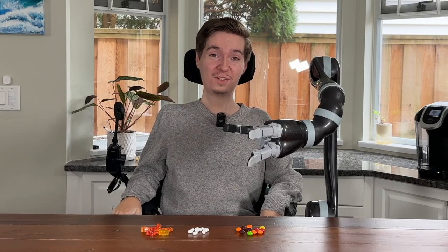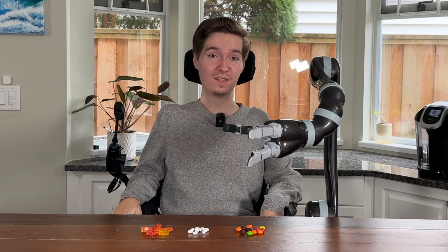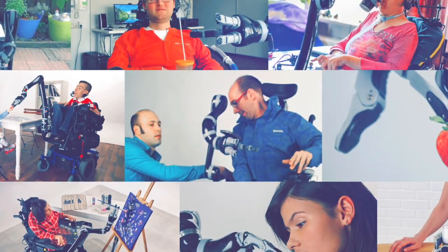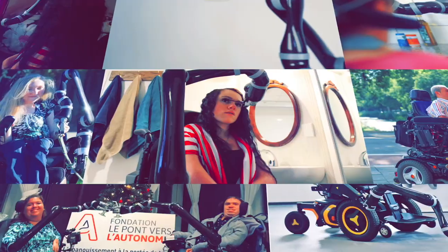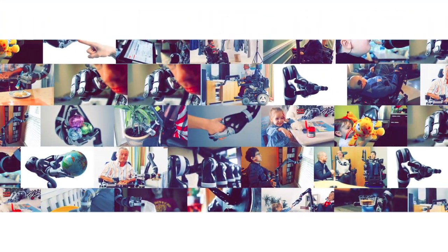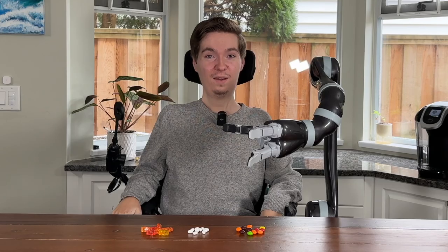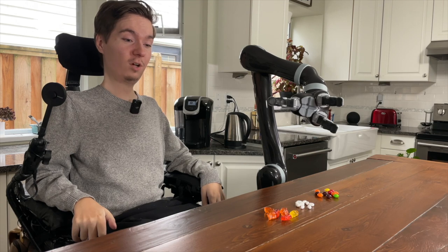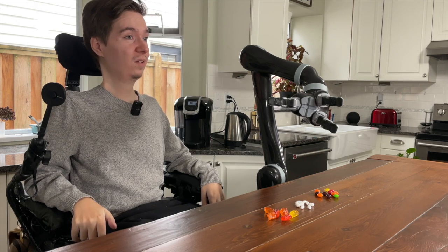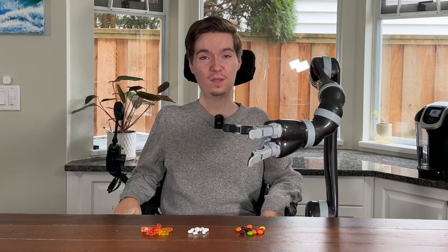Jayco is a great tool for allowing us to complete many activities of daily living. One of the most critical of those is administering your own medication. A great way to practice this skill is by using candy. I've laid out a few different kinds here in front of me to represent pills in different shapes and sizes. As you'll see shortly, Jayco is able to manage all of them very easily.